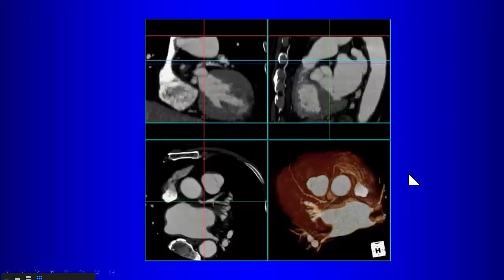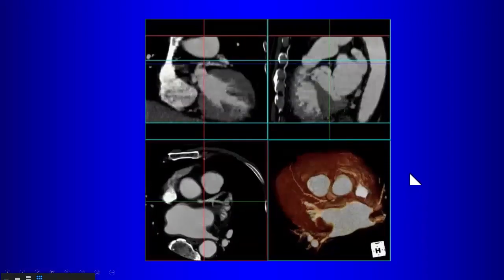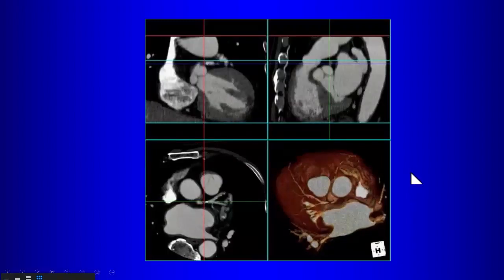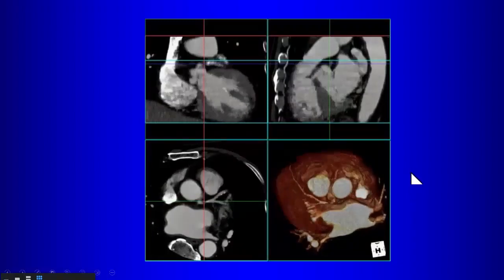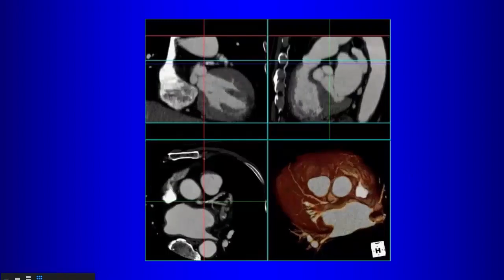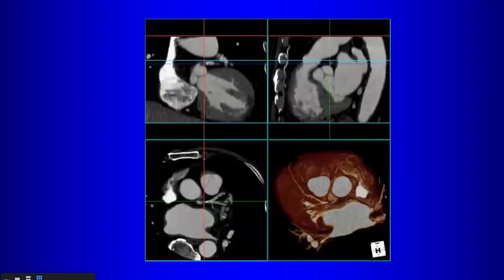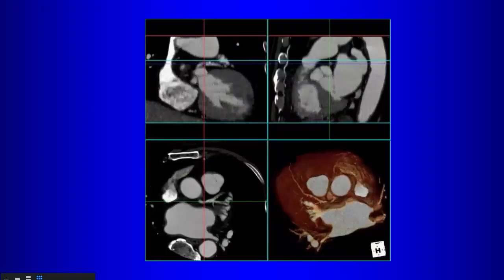No thoughts on that? Well, what's better with cardiac MR as opposed to CT? It's the temporal resolution. So remember that with cardiac MR, your temporal resolution is about 50 milliseconds or so. Here on CT, we're on the order of 200 milliseconds. So because of that, as you're going from one phase to the other, the heart looks like it's jerking.